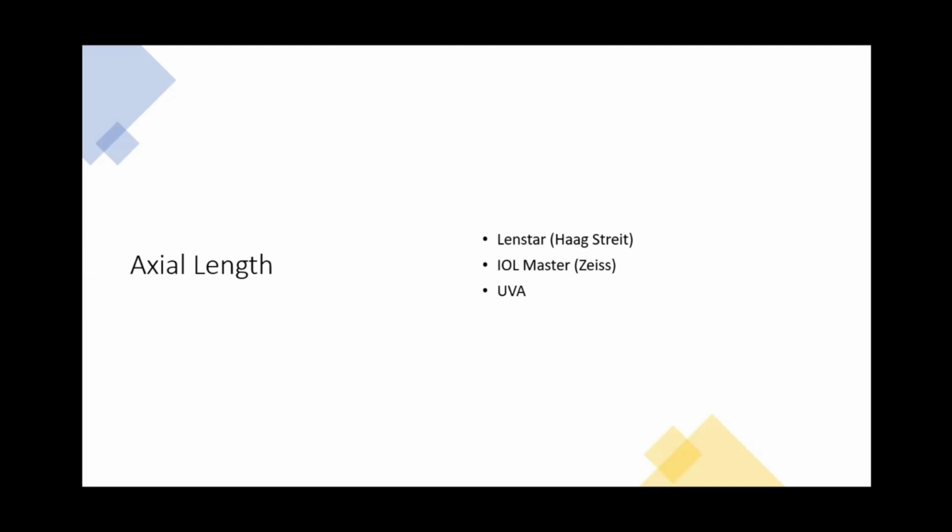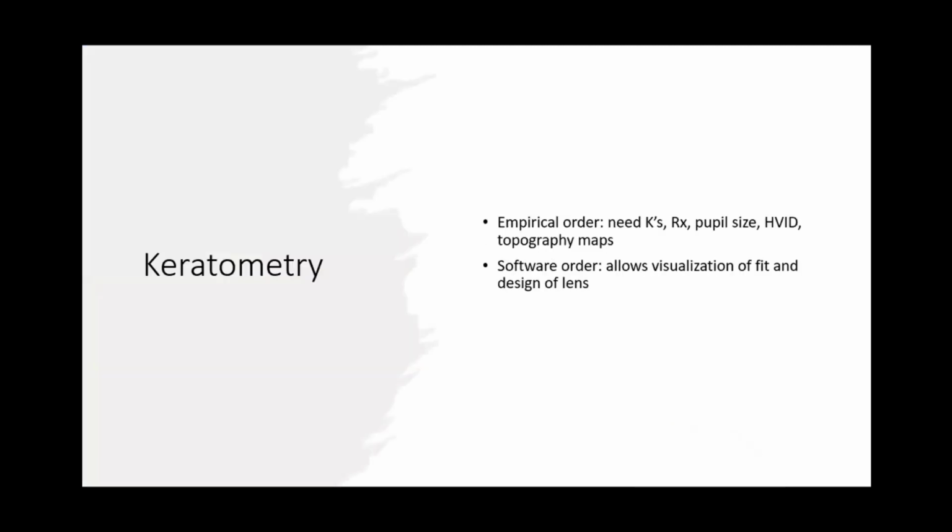Keratometry is also an important measurement to acquire, as you can determine if the majority of the prescription is from the corneal steepness or from a long axial length, because that can potentially change your treatment plan as well. And another benefit is that the information gathered from the scans can help you order ortho-K contact lenses if that is the treatment of choice.